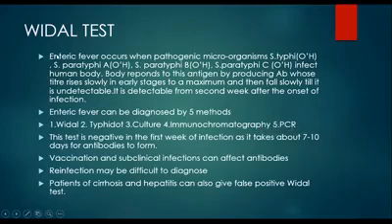So, enteric fever occurs when pathogenic microorganisms, Salmonella typhi, Salmonella paratyphi, and its various forms, infect the human body. The body responds to this antigen by producing antibodies whose titer rises slowly in the early stages to a maximum and then falls slowly till it is undetectable. So normally the antibodies are detectable from the second week onwards.